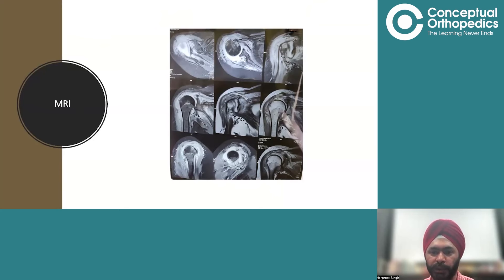This is the MRI of this patient. Looking at the coronal section — this is a fat-suppressed image — the cuff is not going beyond the glenoid, so it is a massively retracted rotator cuff tear. On the sagittal section, there is no rotator cuff either superiorly or posteriorly, so both supra and infra are involved. On the axial section, you see a tendon going anteriorly — the subscapularis is intact but there is no supraspinatus and no infraspinatus — massive rotator cuff tear.